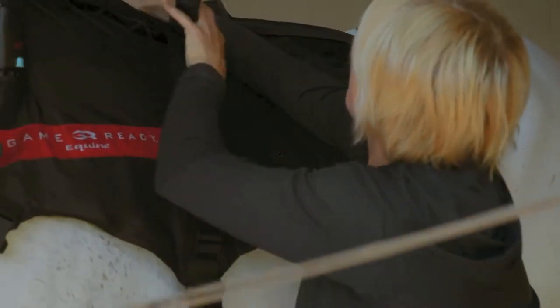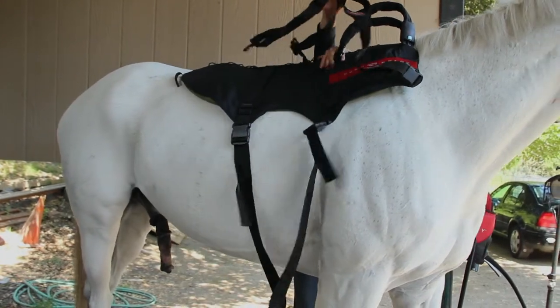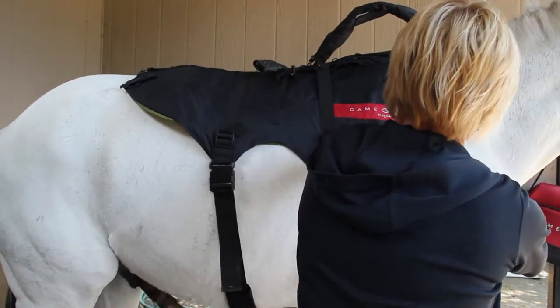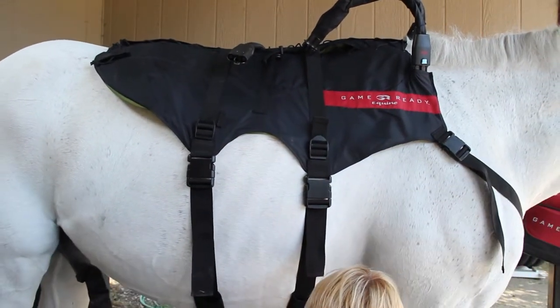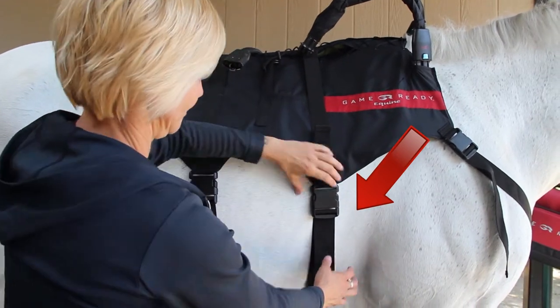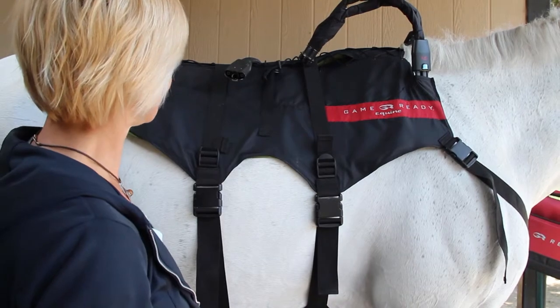Step 1. Place the wrap on the horse's back, aligning the hose connection on the top of the horse's withers, similar to the positioning of a pommel or saddle horn. Draw the front surcingle strap from the far side of the horse, under his belly, clipping to the near-side front buckle. Adjust the tautness by shortening the nylon strap through the sliding buckles on both near and far sides.